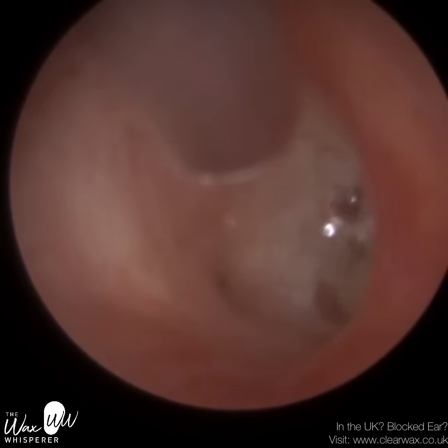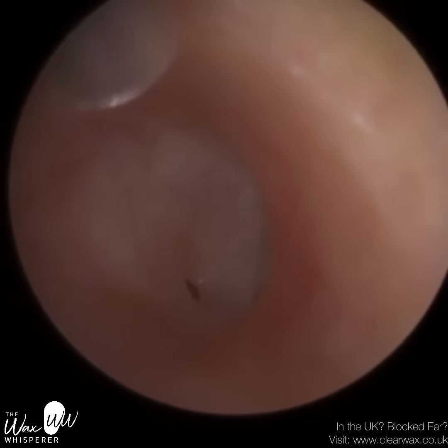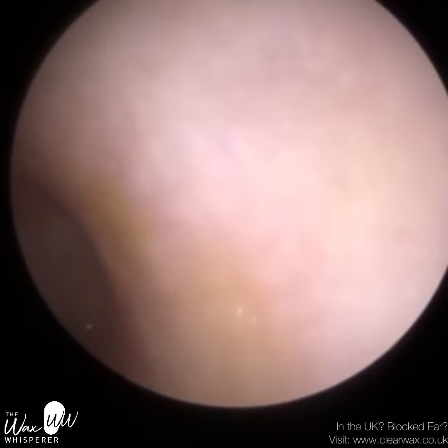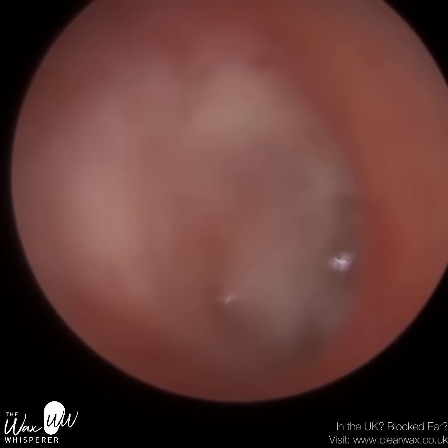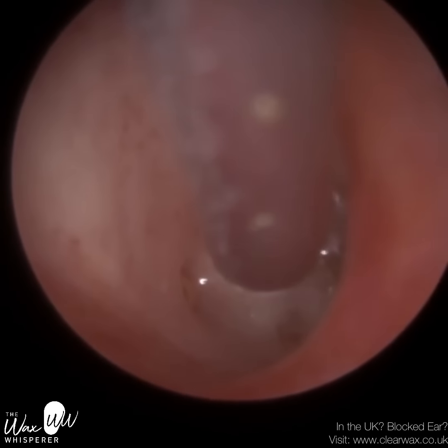Now, you can see it's pumping there to the left. You can see little bubbles. You can see that tiniest little hole there. Now the eardrum itself is infected, so it's very difficult to visualise the normal landmarks. And on the right, you can see some bubbles there as well. That's behind it. That's not perforated on the right.